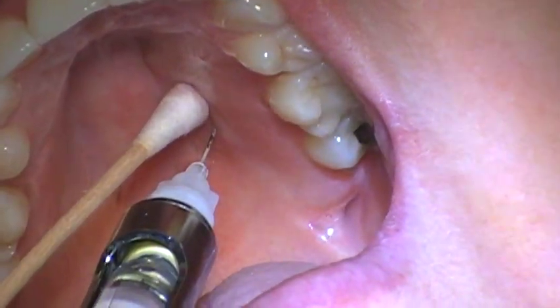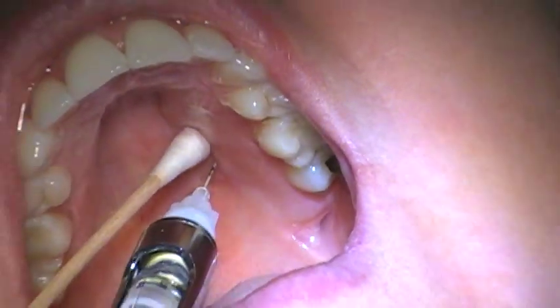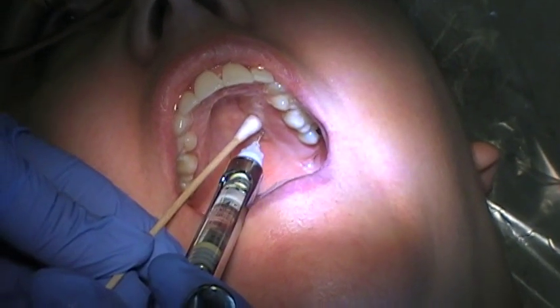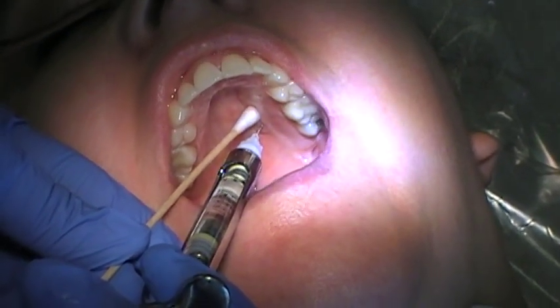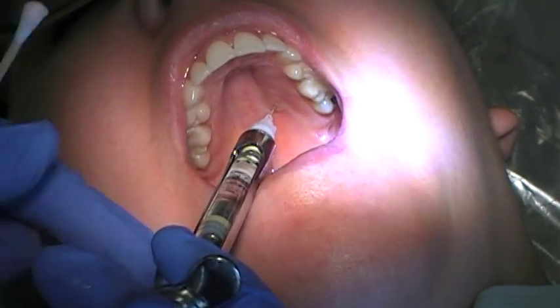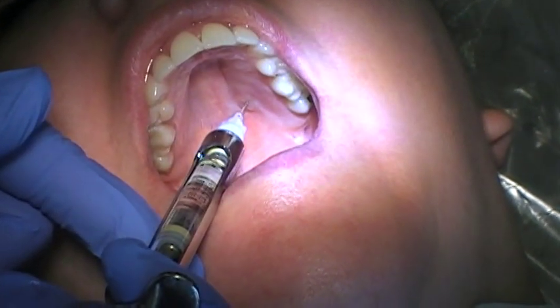She's shallow, so I'm already there. I'll aspirate — it's negative — and slowly deposit. Once I know the anesthetic is taking a little effect and it's more comfortable for the patient, sometimes I'll remove the q-tip so I can steady the syringe.